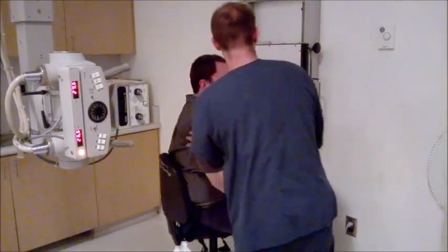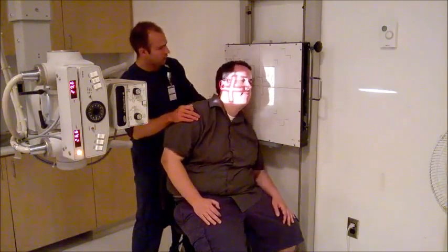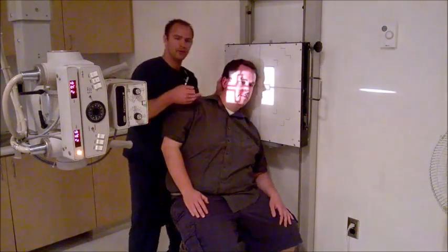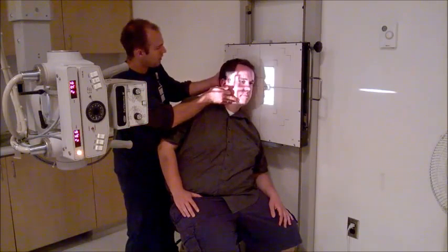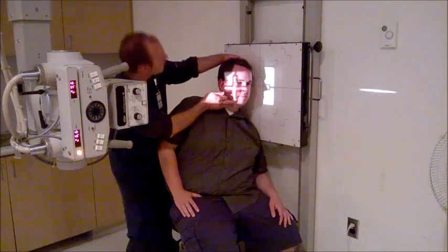All right, sir, we're going to get you on your left side right here. Put your head as close to the board as you can. There we go, and get it nice and straight. So what we have to have is the interpupillary line perpendicular with the IR right here. There we go. Right there, sir. A little bit less rotation. There we go. Perfect.